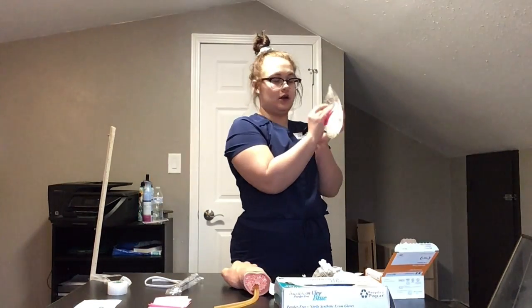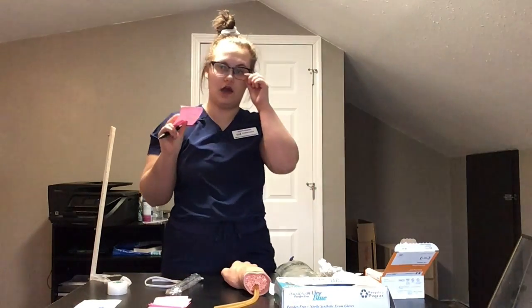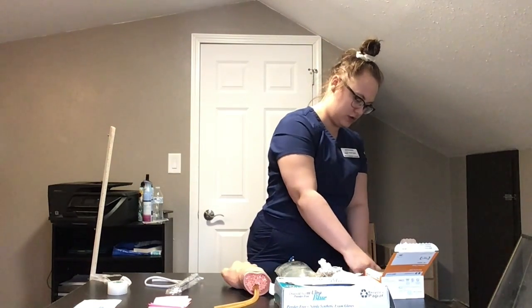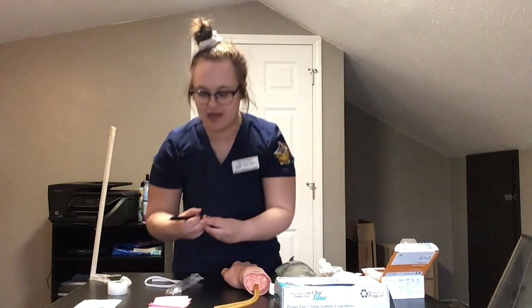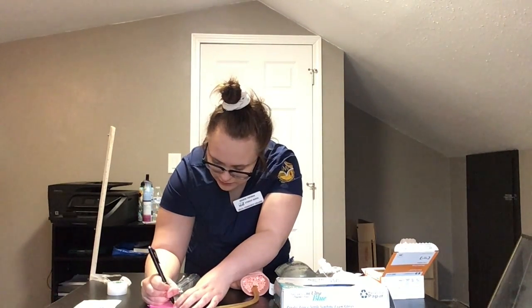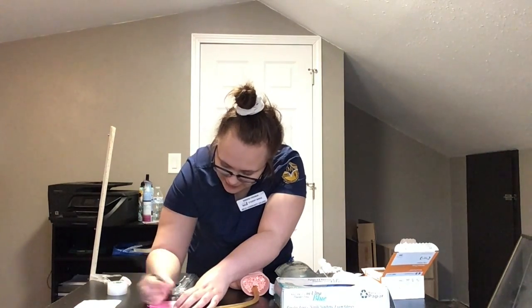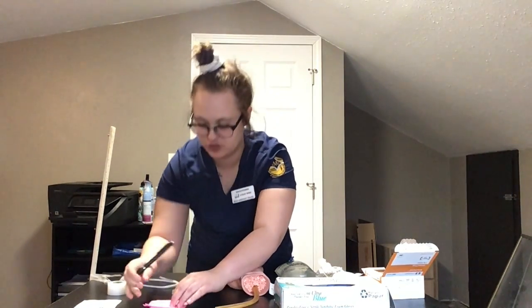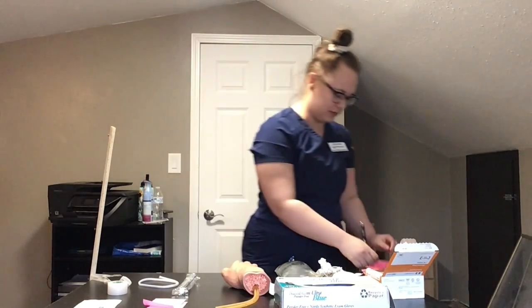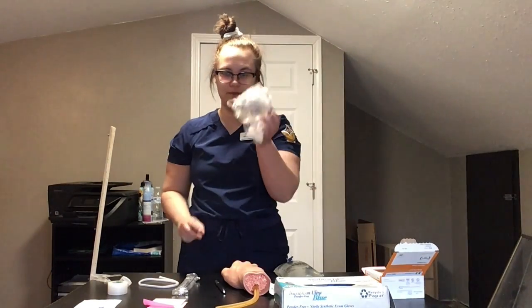So I would put it on here, but since these are kind of big and not their intended purpose, I'm just going to place them over here. And then I would also have a time label with the infusion rate, the time the infusion began, and the time it'll take to finish. And I would put that on the bag as well, but I'm going to be putting it over here. Okay, then I'm going to get my tubing.